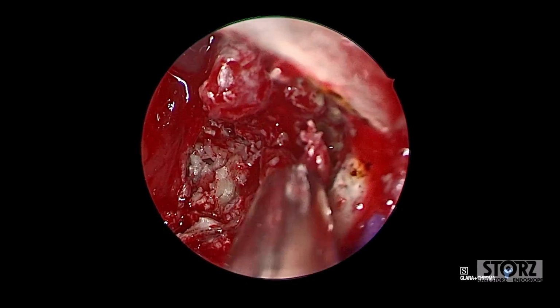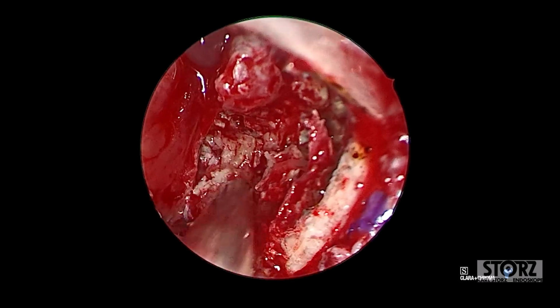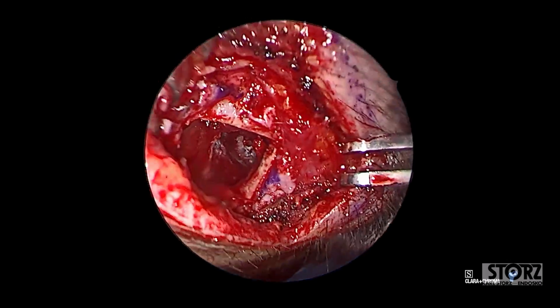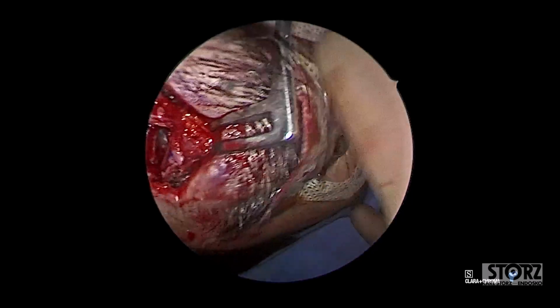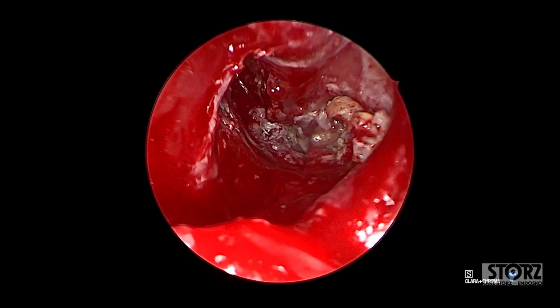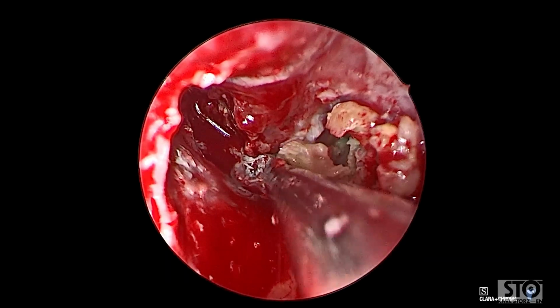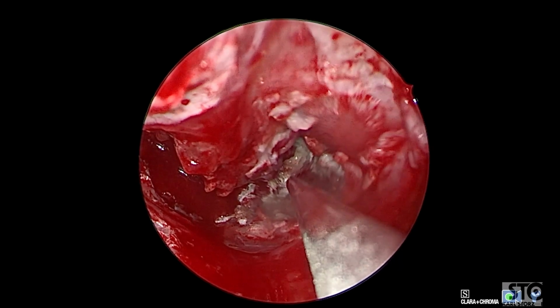The pathology turned out to be a cholesteatoma of the frontal sinus. Initially, it was thought to be allergic fungal sinusitis. It was obviously super infected. This is the orbital dehiscence area. Evacuation of the disease.